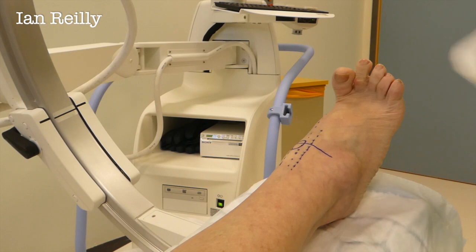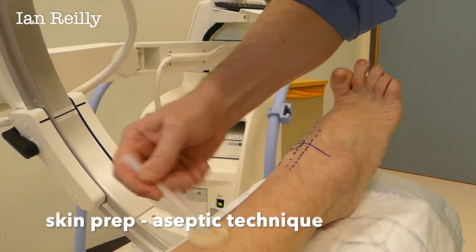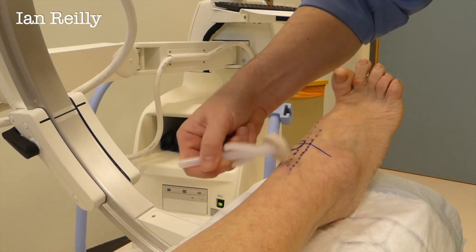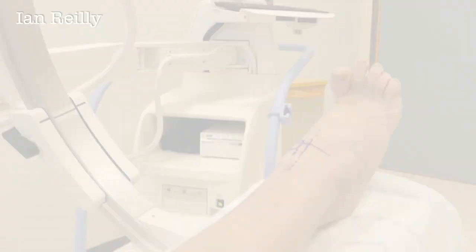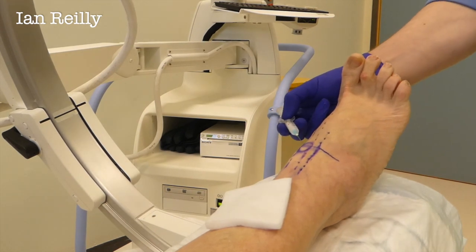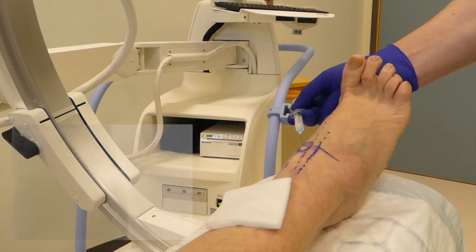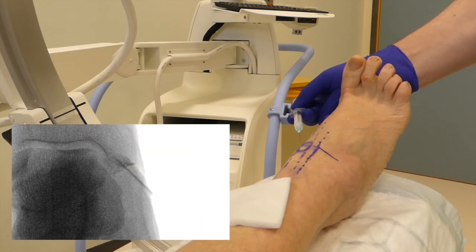A bit of skin prep — we call these chloropreps, we really like these. I'm just getting my hands out of the way; I'm going to do a check x-ray and see where the needle is. So I'm just a little bit low and a little bit across.